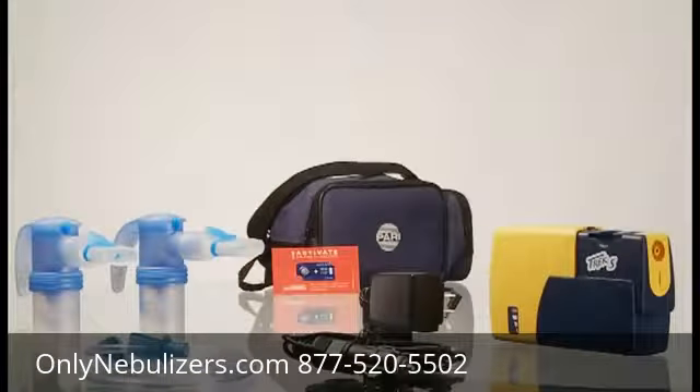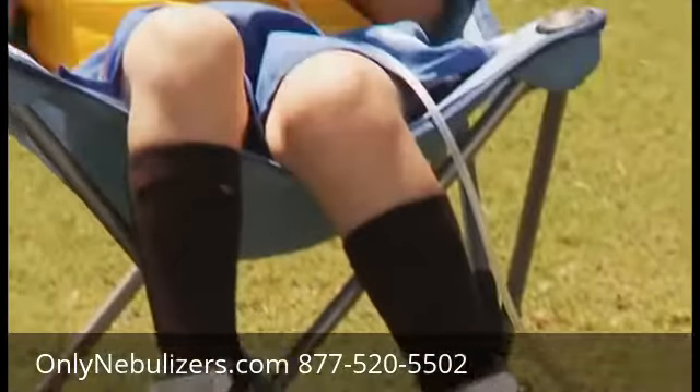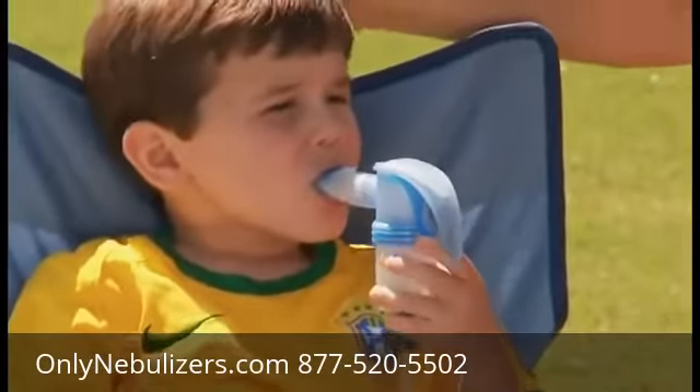Your physician has prescribed the Trek S to treat your diagnosed respiratory condition. Perfect for those with active lifestyles, Trek S allows patients the freedom to take treatments anywhere.